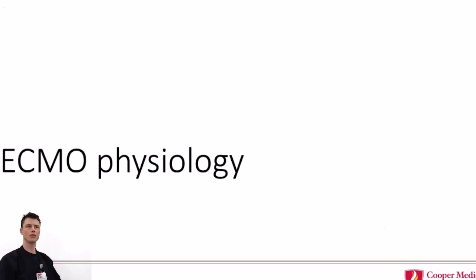Change the flow, right? When we talk about flow, we use the term as the blood flow going through the ECMO circuit. The more blood that we put through the ECMO circuit, the more red blood cells we're putting oxygen onto, the more we're taking off CO2, so the higher we're going to see our patient's oxygen saturation.